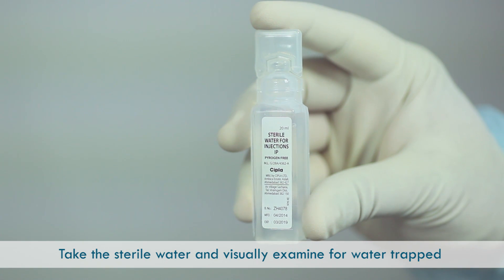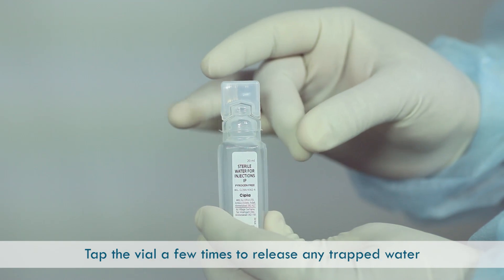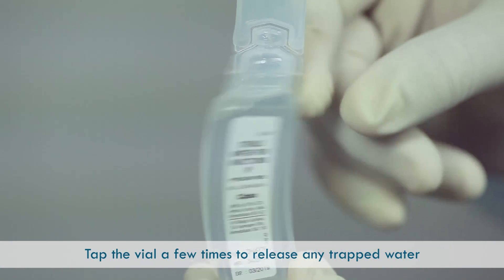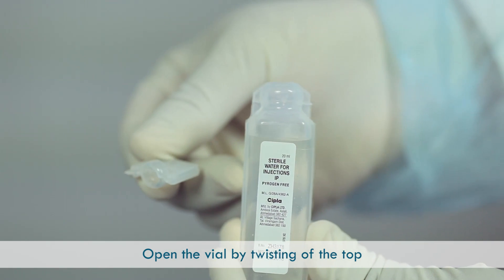Take the sterile water and visually examine if there is water trapped in the top of the container. Tap the vial a few times to release any trapped water. Open the vial by twisting off the top.